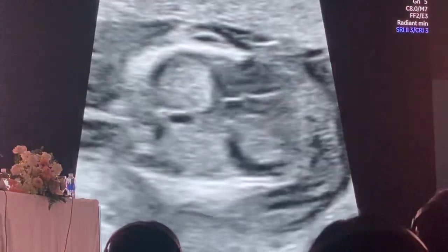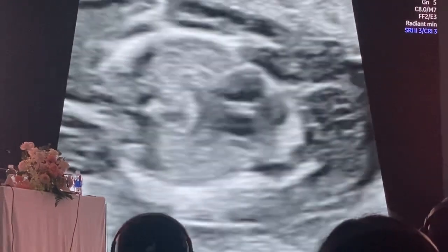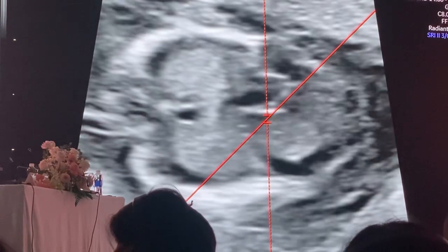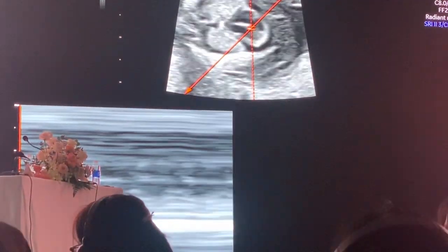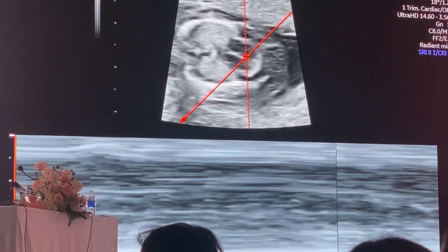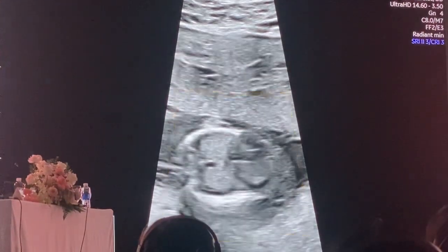Once I've got the HD zoom in view, I've got a point where I can see the 4 chambers of the heart. I'm just wondering about the contractility of the ventricles. So I'm just going to jump straight to M-mode and just see that the ventricles are contracting normally on the right and left side. And then go back to 2D. And then just magnify that again.